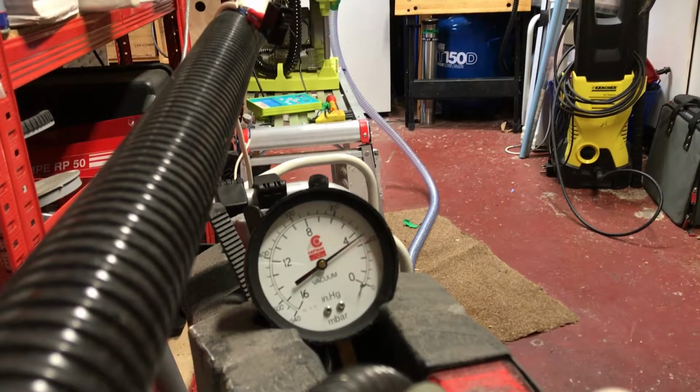Suction tip back on there. Also, you'll have seen that the pipe has now cleared itself of any fluid, which we're really pleased about, as there's nothing sticking in the tube. And I'll just switch it off. Brilliant.